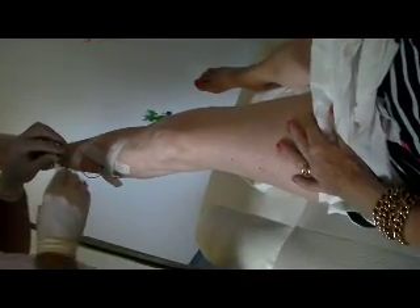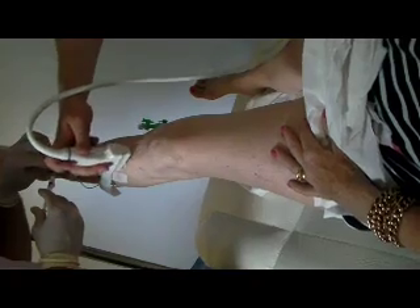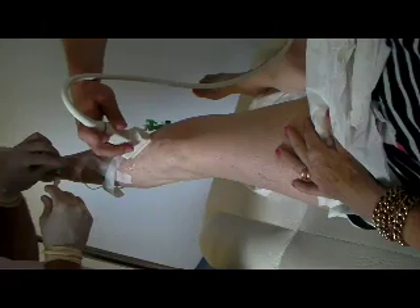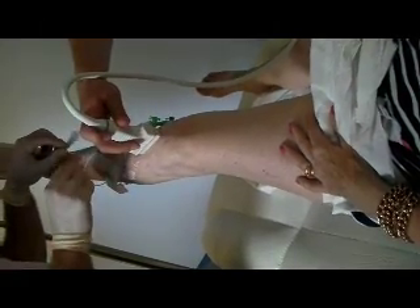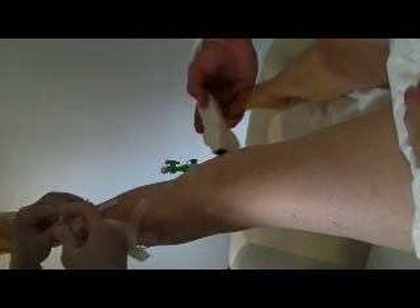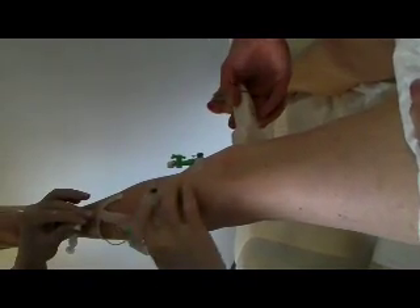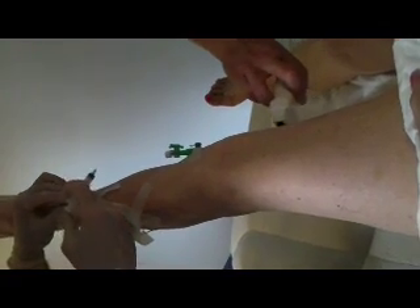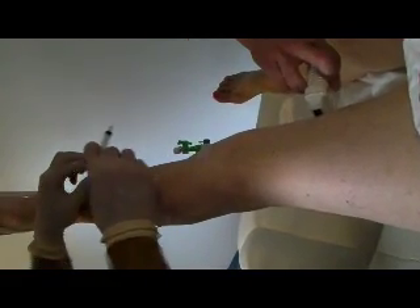The foam is first injected into the smaller needle. The reason for this is it passes into the veins that usually cause the patient problems, but also it can make the vein in the thigh go into spasm, which means less treatment is therefore required subsequently. The ultrasound once again is used to monitor where the foam passes, and you can see in this clip that both the doctor and the scientist are working together. The doctor can massage the foam into the veins that are affecting this patient.